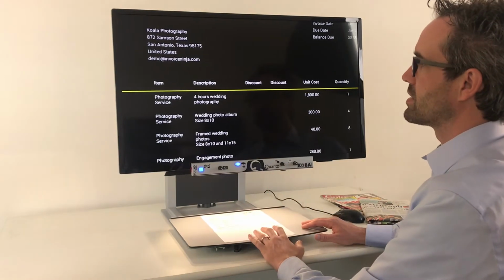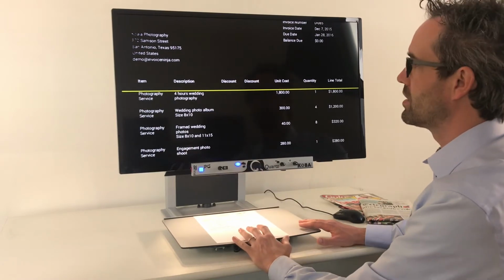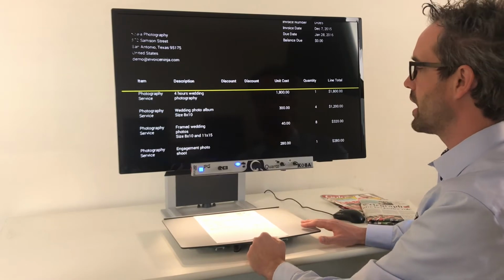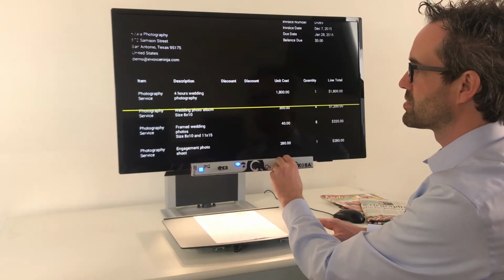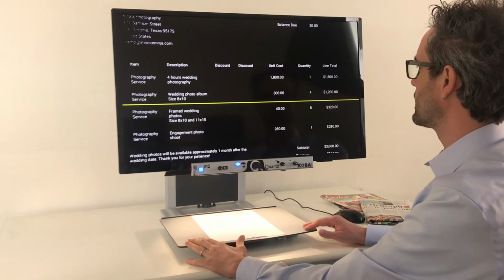Press and turn to set line position, press and turn to set line zoom out. Now we see that there is a reading line on the screen. It's yellow. By turning the button you can set the position up or down, or you also can move the sliding table.